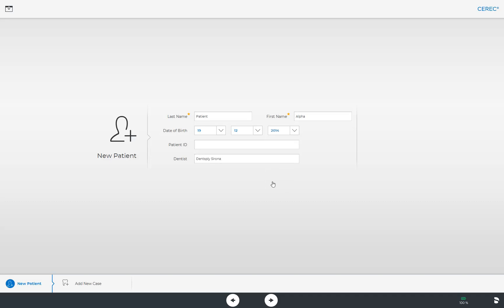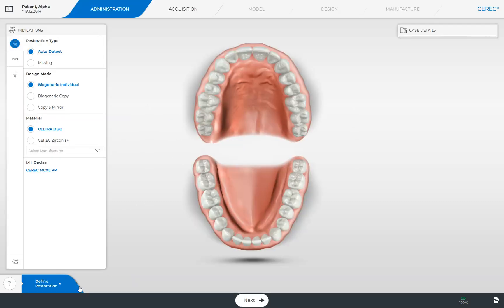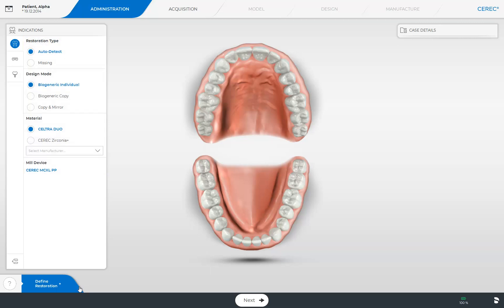Then we tap the button Add New Case at the bottom edge of the screen. The CEREC software takes us automatically to the administration phase where we determine the restoration type, design mode, material, mill device, as well as the position of the restoration within the odontogram.